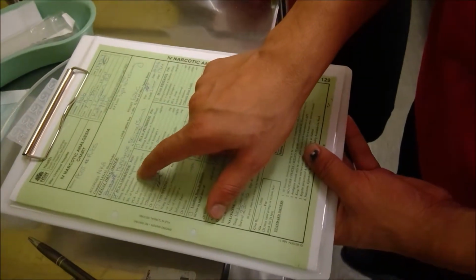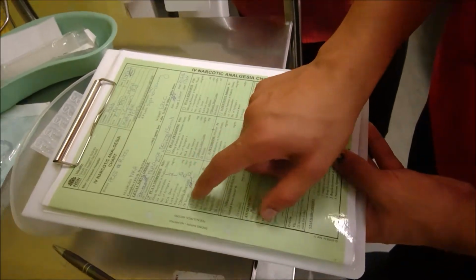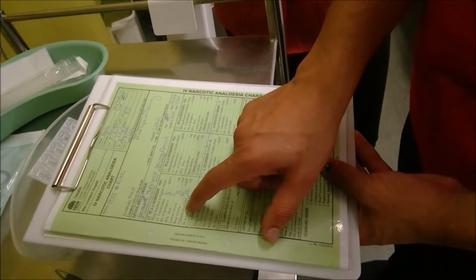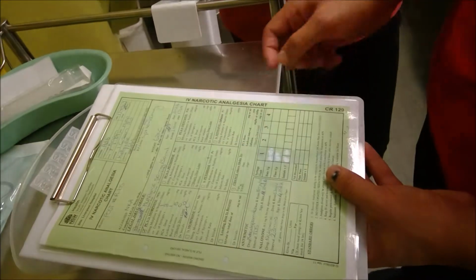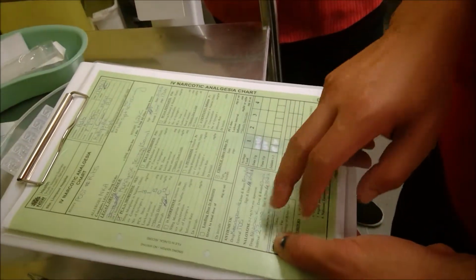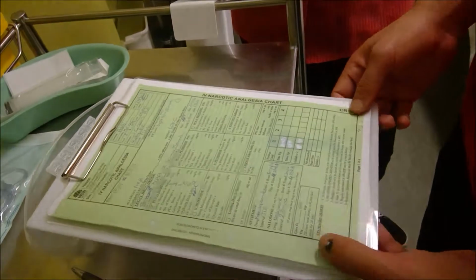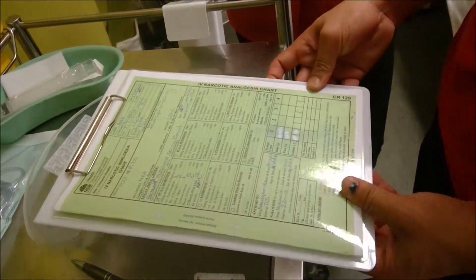The concentration is 1 milligram in 1 mil. Number of syringes we'll be using is 3. PCA dose is 1 milligram. Lockout interval is 5 minutes. The basal infusion is 0 milligrams per hour. The hourly dose limit is 12 milligrams an hour, and the doctor has signed for it. It hasn't been given yet. We also have antiemetics, Maxolon 10 milligrams through IV, and naloxone 0.2 milligrams through IV. These are for nausea and vomiting and reversals if the patient requests it.